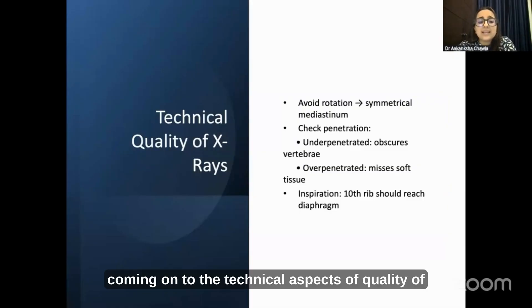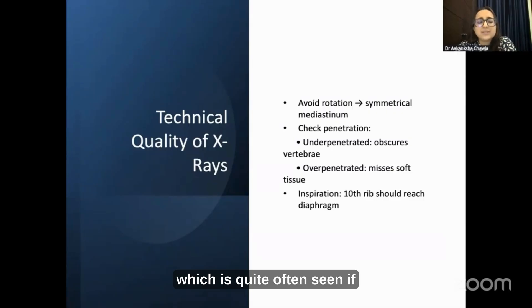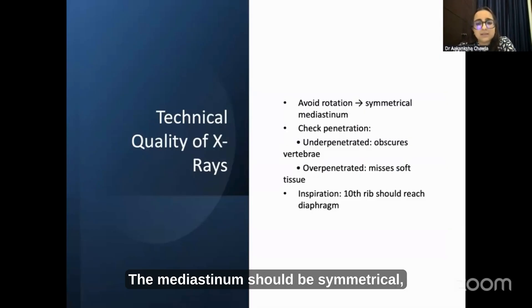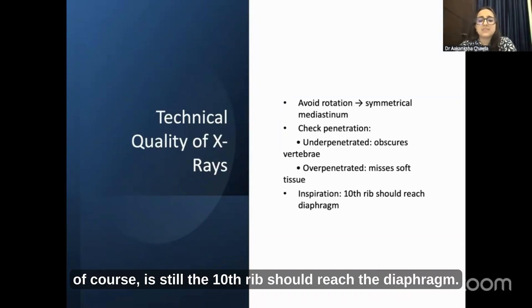Regarding the technical aspects of X-ray quality, you must try to avoid rotation, which is quite often seen if your X-ray is not well-positioned, especially in the ICU. The mediastinum should be symmetrical. Check for penetration — under-penetrated films obscure vertebrae, over-penetrated films miss soft tissues. For inspiration, the 10th rib should reach the diaphragm.